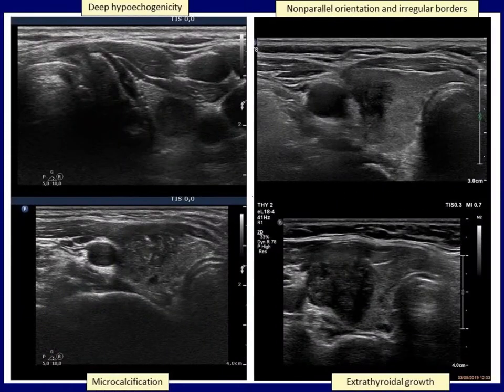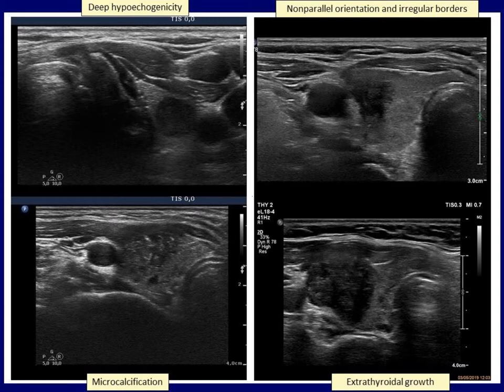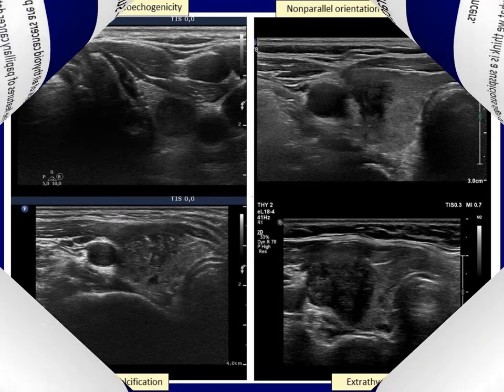Let's see some examples. The left upper nodule is darker than the strap muscle, therefore this is a deeply hypoechoic lesion. The left lower nodule has several bright echogenic foci — microcalcifications. The depth of the right upper nodule exceeds its width, meaning a taller-than-wide shape. This nodule also has irregular lobulated margins. The right lower nodule clearly extends into the strap muscle. What these four different cases have in common is that all proved to be papillary cancer. Suspicious signs mean suspicious of papillary cancer.